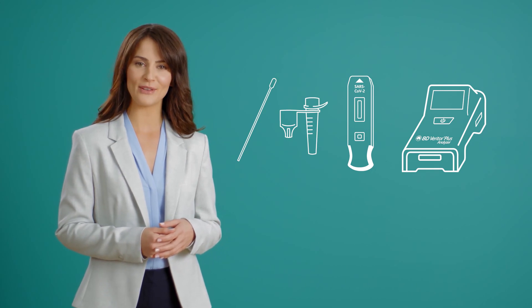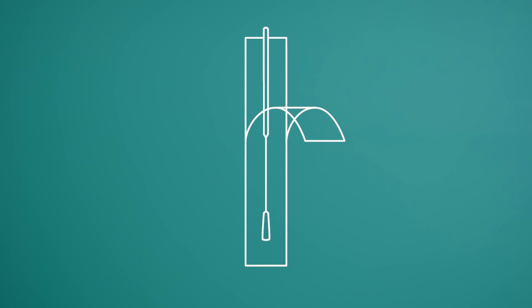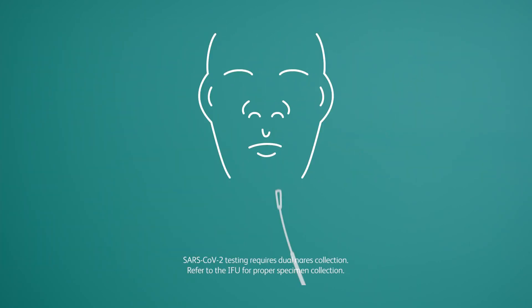Now that you've gathered your test materials, it's time to perform the test. First, peel down and remove the nasal swab. Then collect the sample by inserting the swab up to one inch into each nostril and rolling five times.